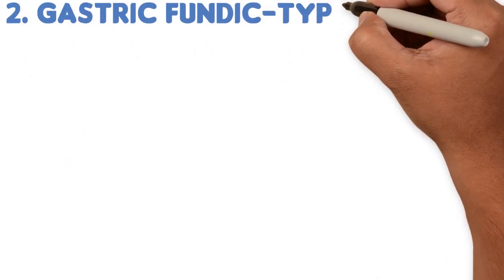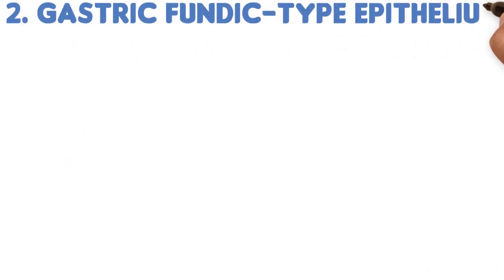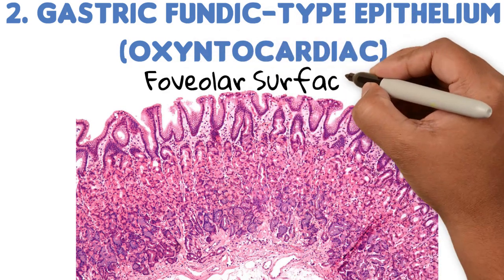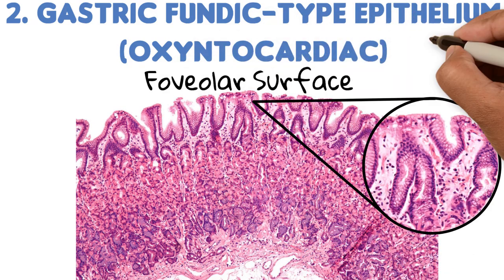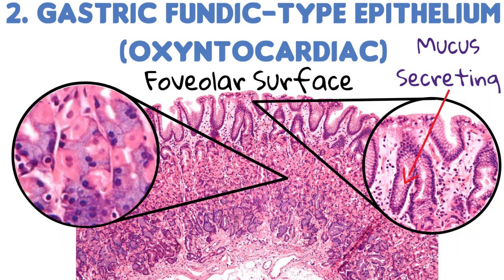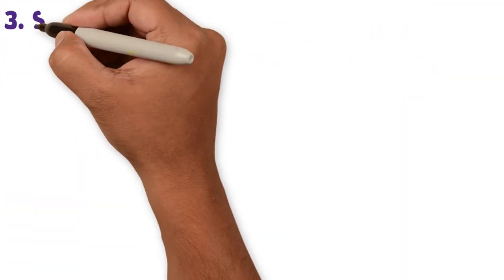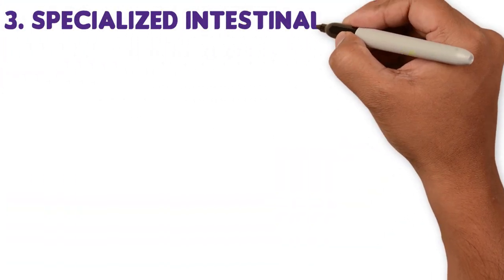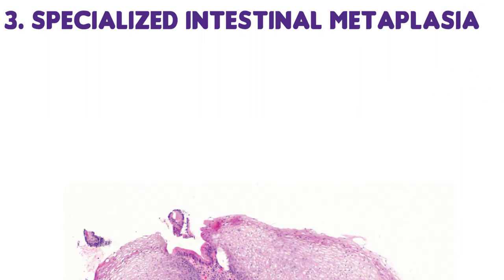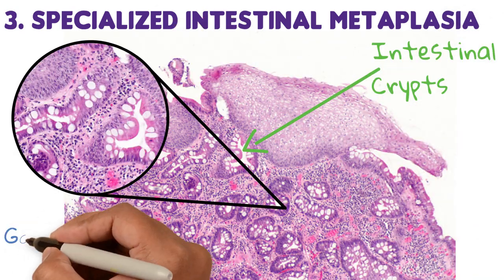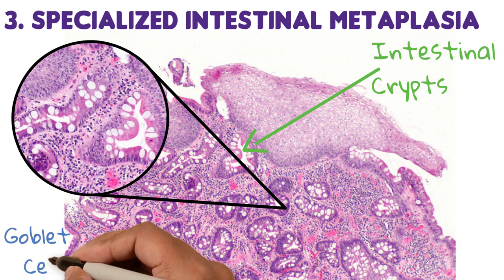Number two: the gastric fundic-type epithelium, also known as the oxyntocardiac epithelium, which has a foveolar surface as well, mucus-secreting cells, and also chief and parietal cells — it resembles the histology of the gastric fundus. Number three: specialized intestinal metaplasia, which has intestinal-type crypts lined with mucus-secreting columnar cells and has goblet cells.